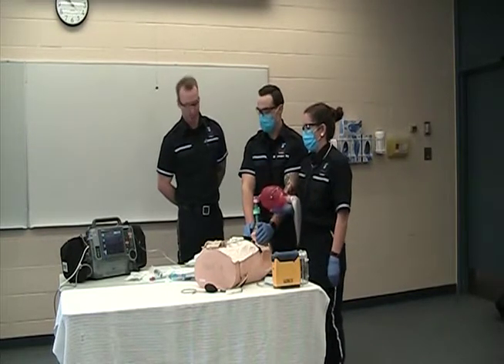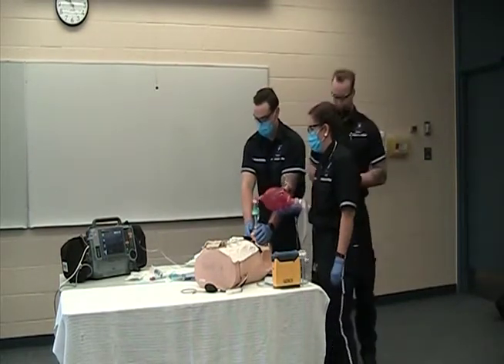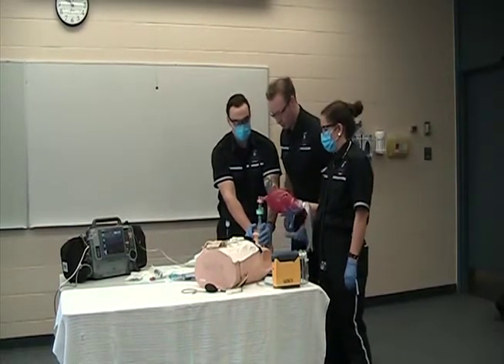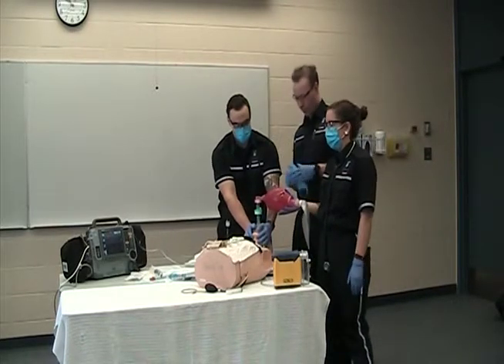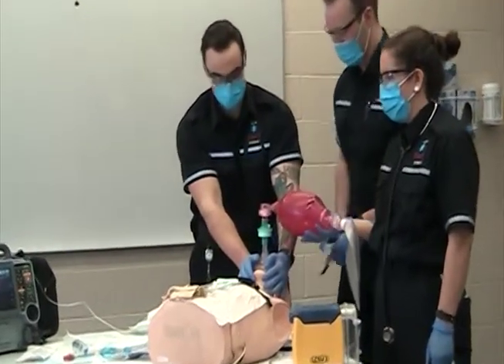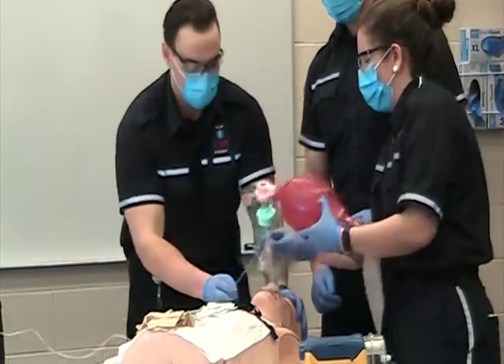Of course. So, get my blade ready. We'll provide a few more breaths, and then we'll be ready to intubate. And get my mask on. Okay, so if you guys are ready, then I'm ready. Yep, we'll give one last breath here. Okay, and let's pull out the OPA.